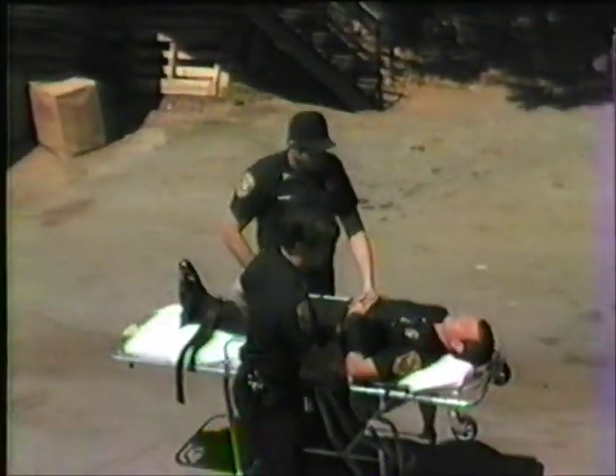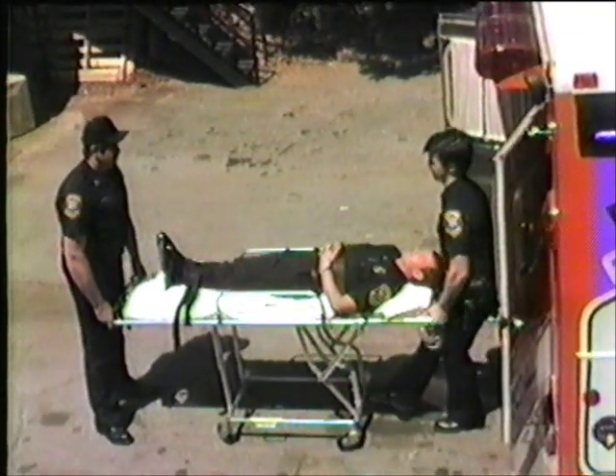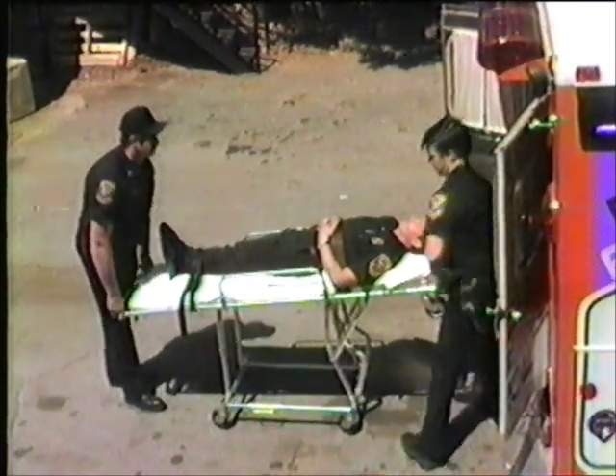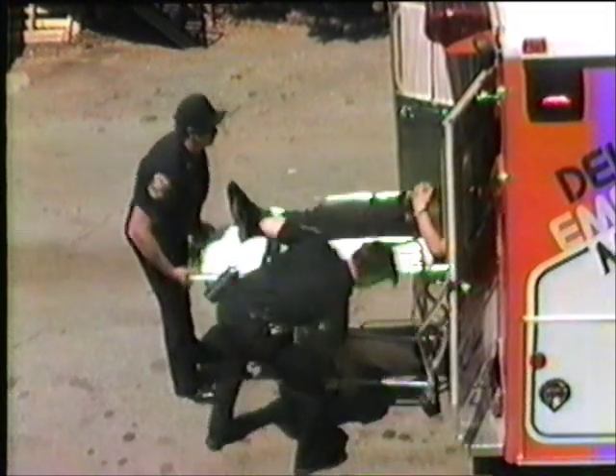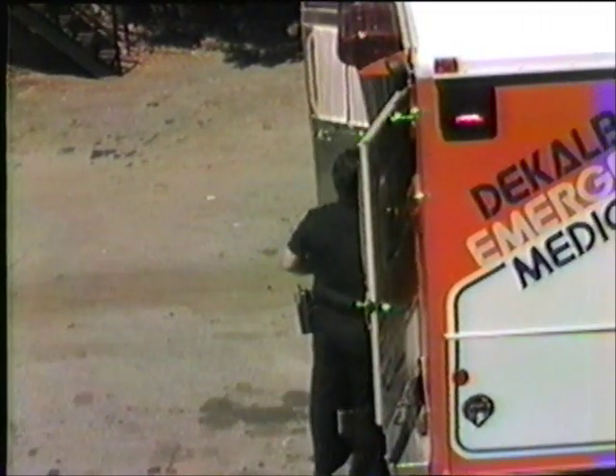The model 29M roll-in cot is not a one-man stretcher. These cots are designed to aid movement of a patient either by rolling on their own wheels or by transport in the patient compartment of an ambulance. Two attendants are required for safe operation. Both should be thoroughly familiar with controls and operating procedures of the stretcher.